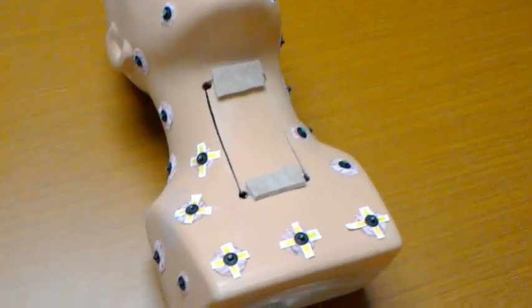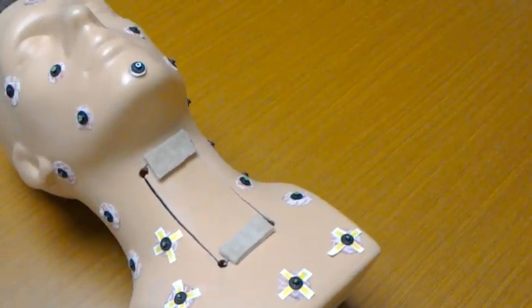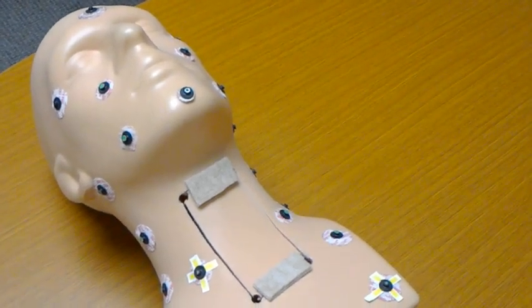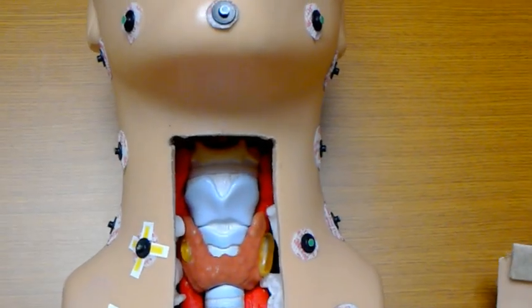As you can see, there's a number of fiducials around the model. We're actually only using 5 of them in the registration process, but obviously they help to synchronize the virtual and physical models. I'm going to remove this flap here just to show you some of the internal structures.